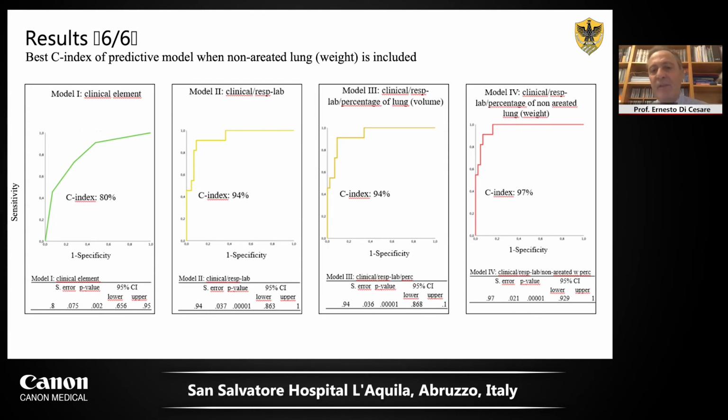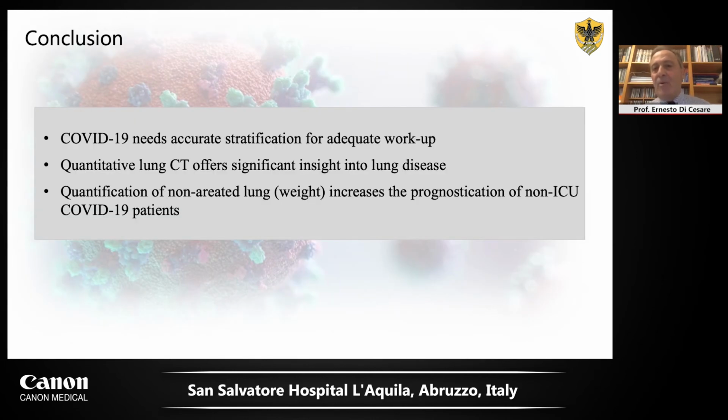But if you add the weight of non-aerated lung, you can see an increase of this index to 97%. And this is our best result.